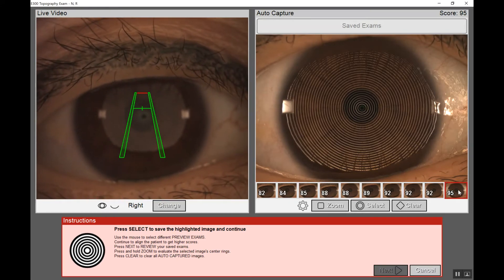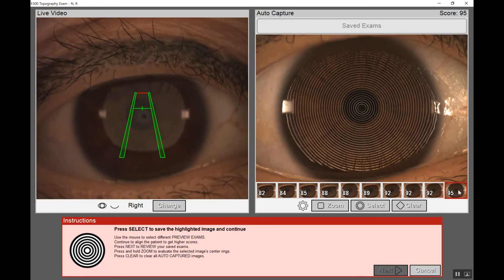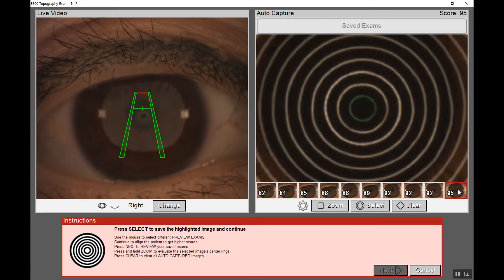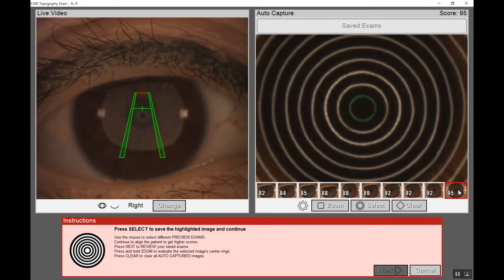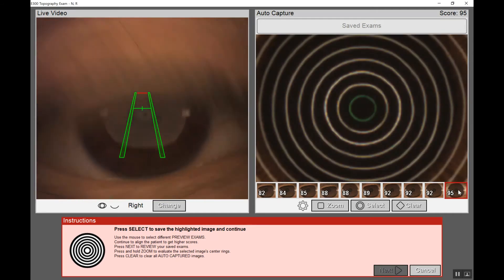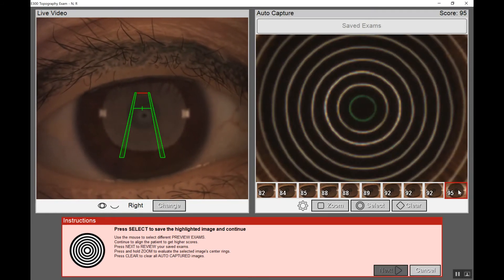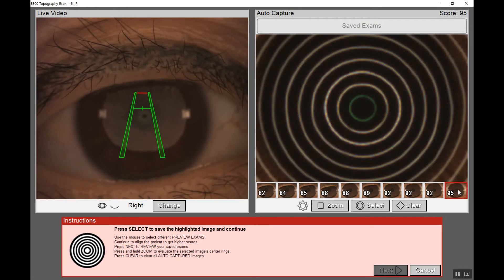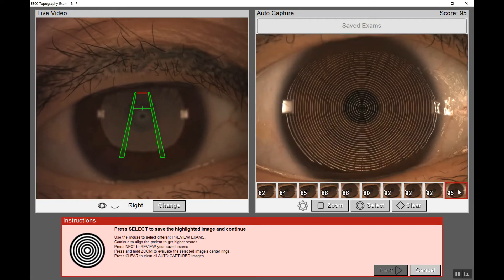Then we can click on the square button on the base of the unit to zoom in and ensure that the instance we took this photo, the tear film was smooth and even. We didn't have any tear film breakup that might distort the rings and the accuracy of the capture.